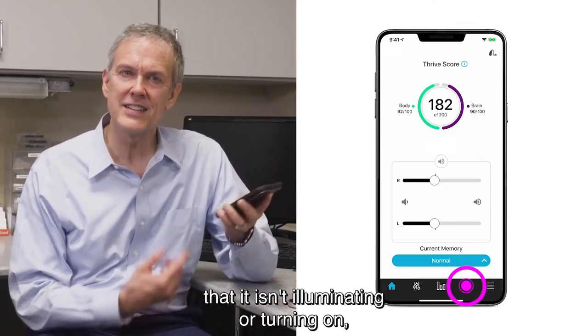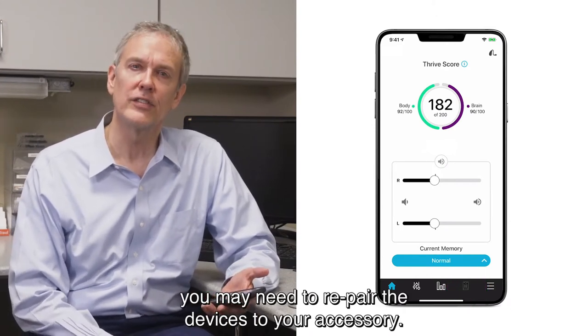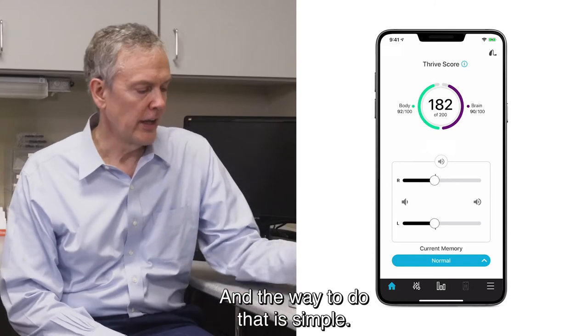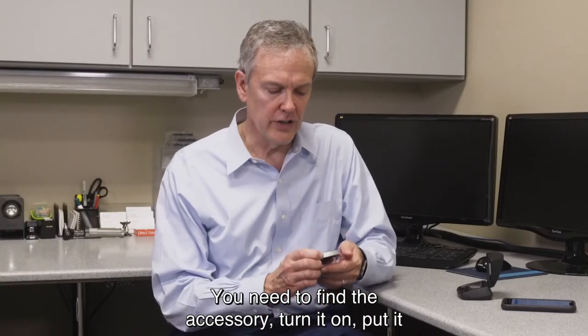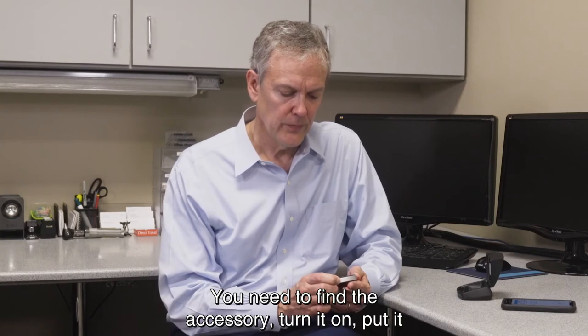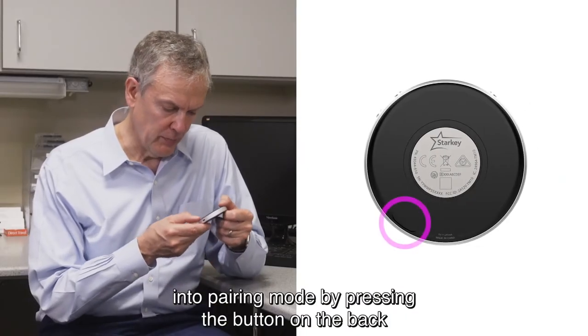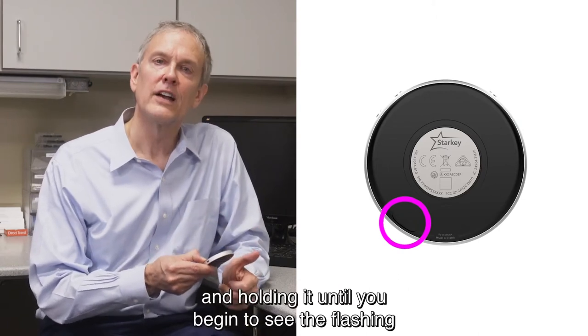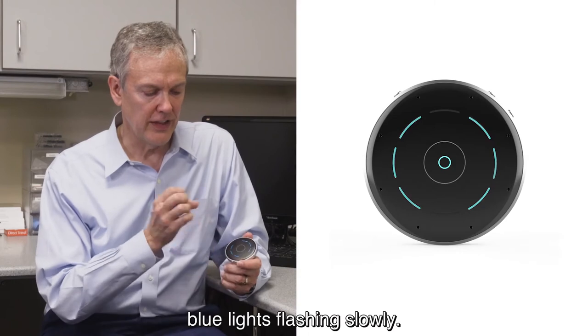If for some reason, like I have right here, it isn't illuminating or turning on, you may need to re-pair the devices to your accessory. To do that, find the accessory, turn it on, and put it into pairing mode by pressing the button on the back and holding it.